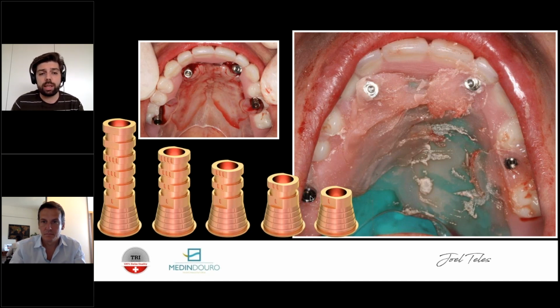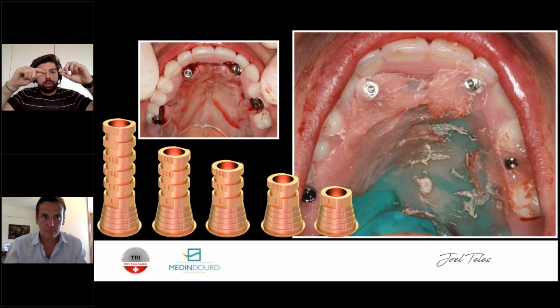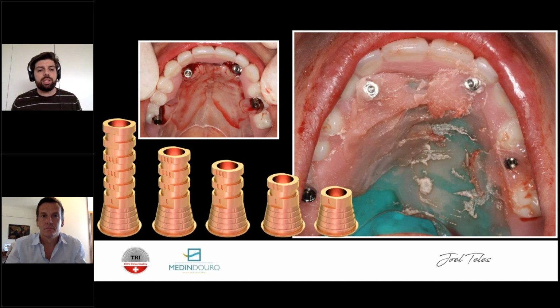That's one of the main mistakes. If you ask me about all-on-4, what's the main mistake? It's not about positioning the implants normally. It's about not understanding the restorative space that is taken in order to keep everything in place. So tell your patient, smile as high as you can. Really move your lip up as high as you can. And that is the image that you should capture, because that's the one that will tell you how much bone you need to cut in order to hide those transition lines and still have enough restorative space to get good, cleanable, and resistant restorations.